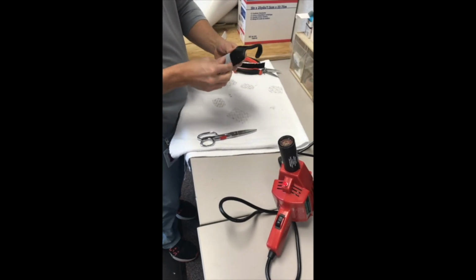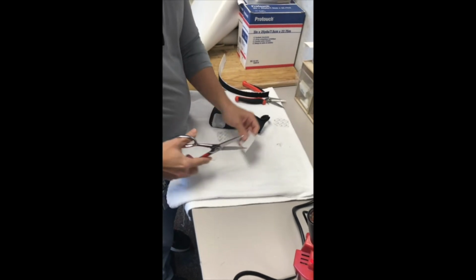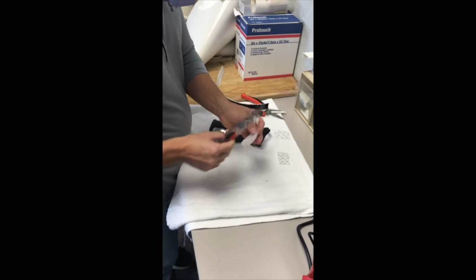So I do not like that. That does not look pretty, okay? Cosmesis of your splint is very important because it represents the profession.